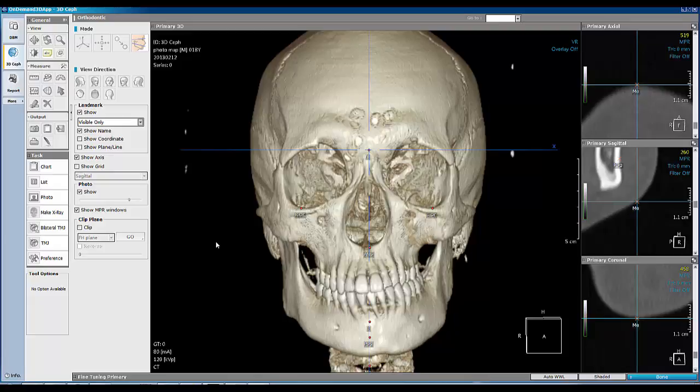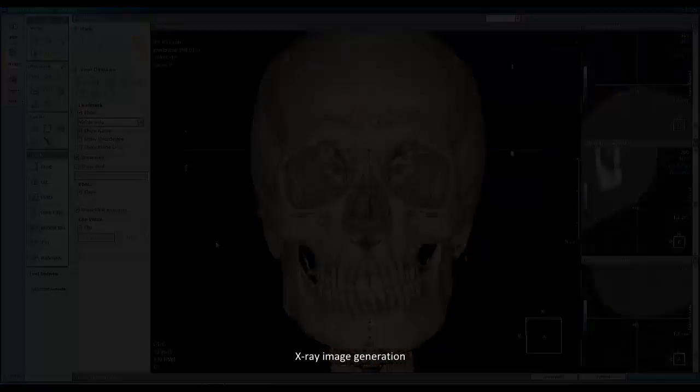Welcome to the video tutorial on on-demand 3D software. This video will cover the 3D Ceph module, particularly x-ray image generation.